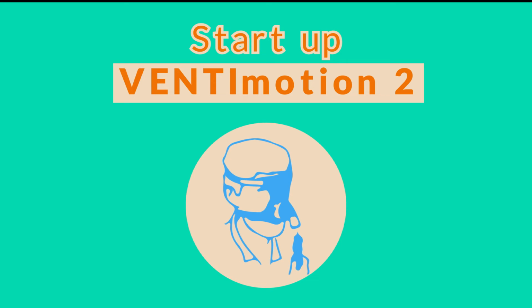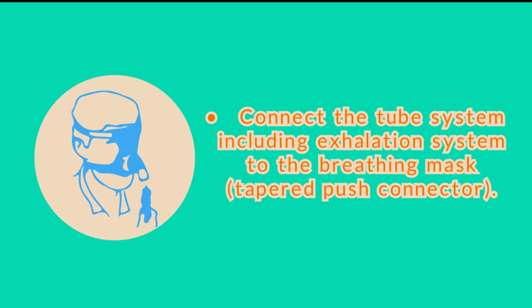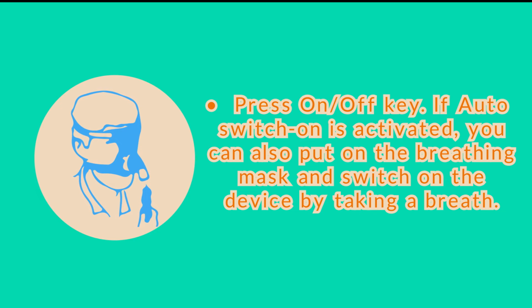Start up Ventimotion 2. If your breathing mask has no integrated exhalation system, plug the exhalation system onto the end of the tube system. Put on the breathing mask. Connect the tube system, including exhalation system, to the breathing mask, tapered push connector. Follow the instructions for use for the breathing mask and exhalation system in question. Press on/off key. If auto switch on is activated, you can also put on the breathing mask and switch on the device by taking a breath.